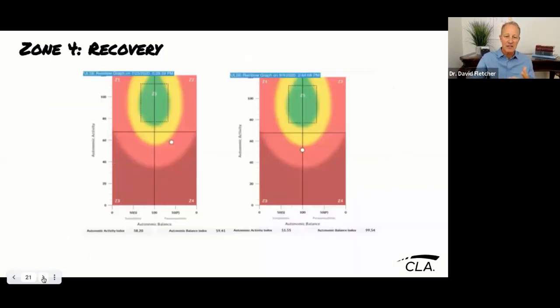And here's an interesting one that I put in, is that we start with, on the left-hand side, a zone 4 plot point that we see, and it's really desperately difficult when you get these patients to see improvement, especially in their autonomic activity. But this is indeed a patient that has moved from that stage 4, fourth zone classification more to the central line.